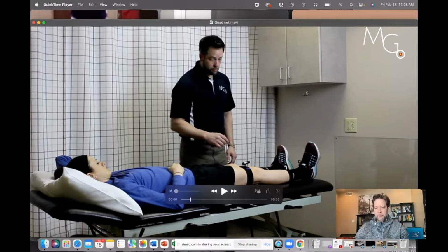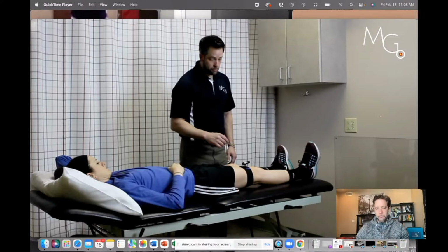We're going to take that medium-sized strap out of the clinician kit. For the people that have our newest version of this kit, we have four straps. We have one that goes along the wrist. The next one up from that is the one that I typically use for the knee. Then we have one that's going to be more around the head neck area. Then the next size up is usually for a trunk or as an extender for those patients that are definitely larger. So I tried to standardize the application here.